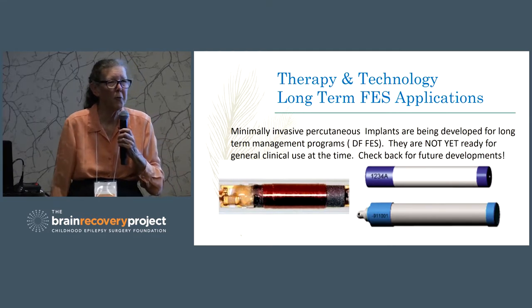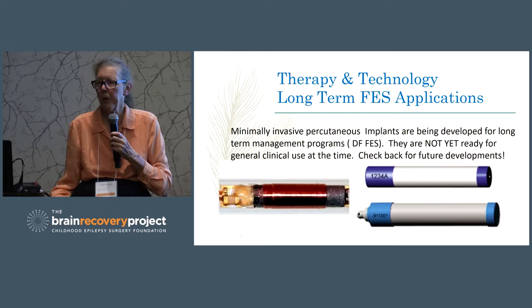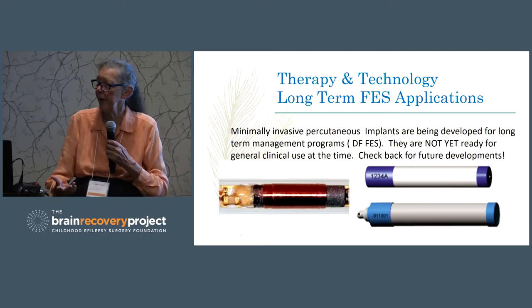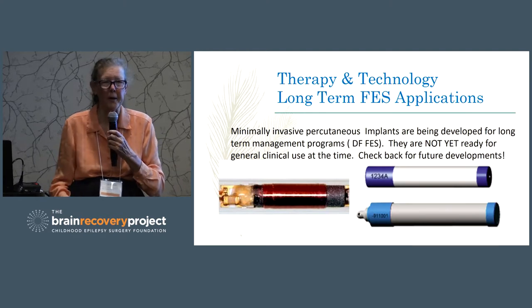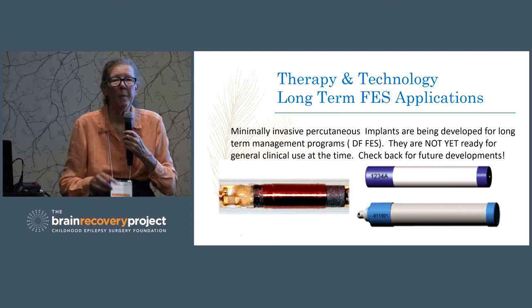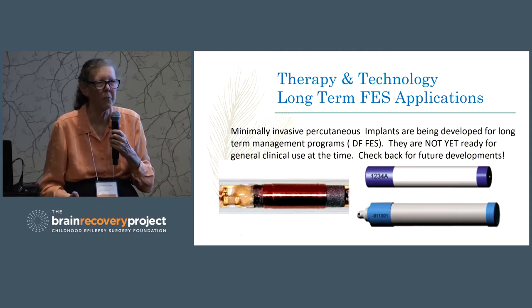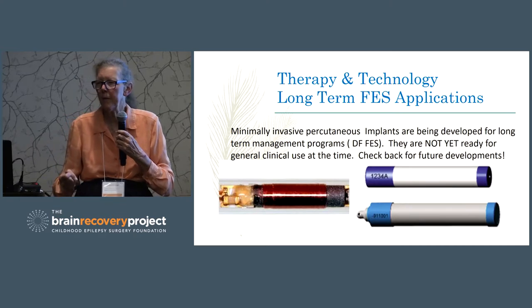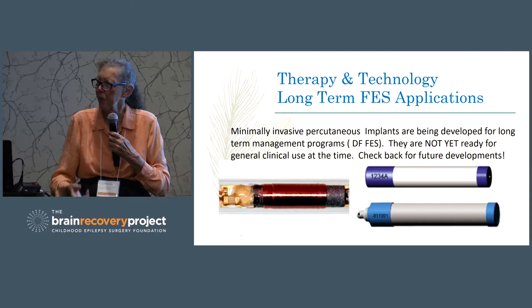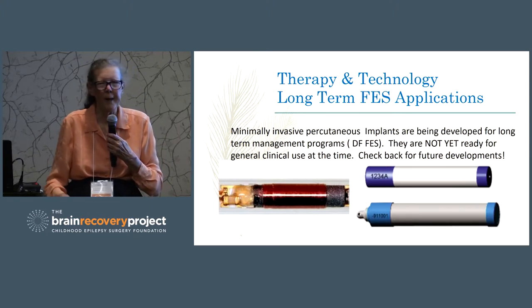For our spinal cord injury patients that sit for long periods of time, they are prone to pressure sores because they don't have sensation. And so they sit and they don't jiggle like y'all are jiggling really nicely. So you don't sit still. But somebody who's had a spinal cord injury does, because they don't feel like they need to move. And so we're using these in the butt to give them a strong muscle contraction, raise them up a little bit, and relax and do that.